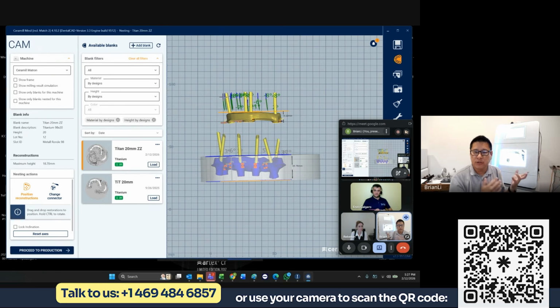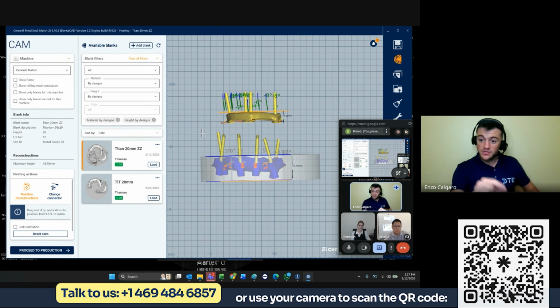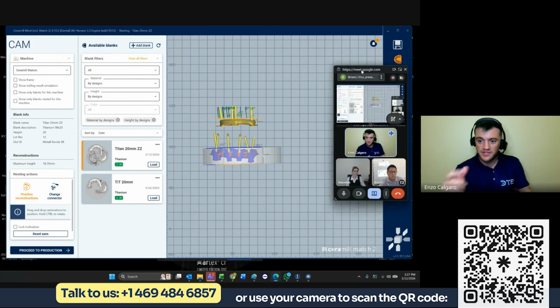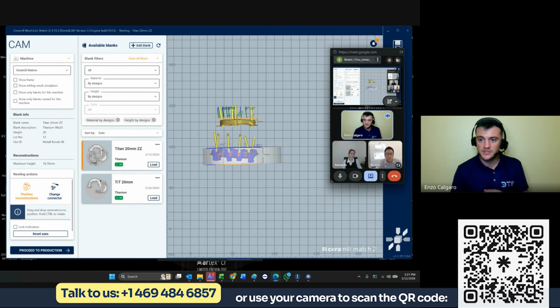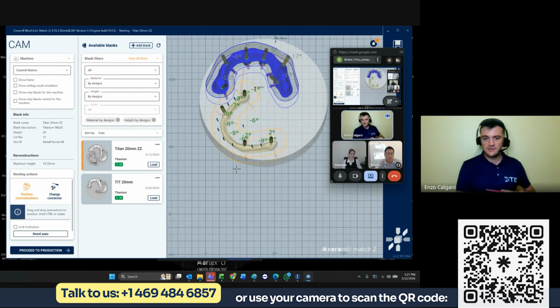Okay, so now we will go to the mills. These jobs are calculating, and they can be thrown to the different mills that we have. The first mill we're going to talk about today is the Brian, really quick. Can you just put a random case to calculate while you show us the mill, and when you come back, show us the simulation? I think it will be nice for people to at least see a simulation. Okay, let's do the bar. It's going to be easier.